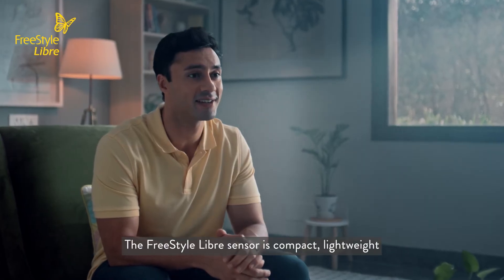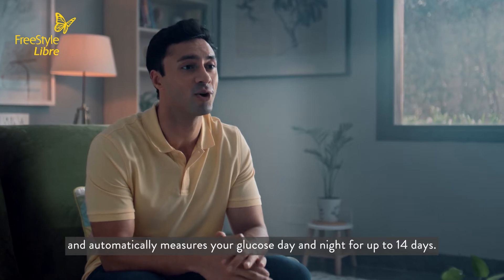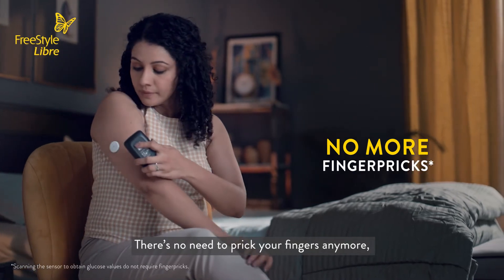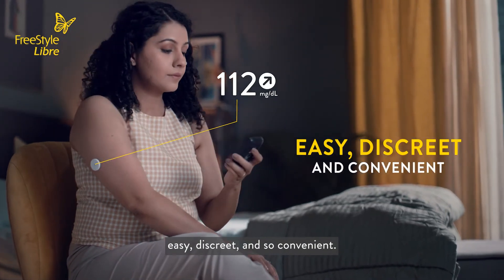The Freestyle Libre sensor is compact, lightweight, and automatically measures your glucose day and night for up to 14 days. There's no need to prick your fingers anymore, which makes glucose monitoring easy, discreet, and so convenient.